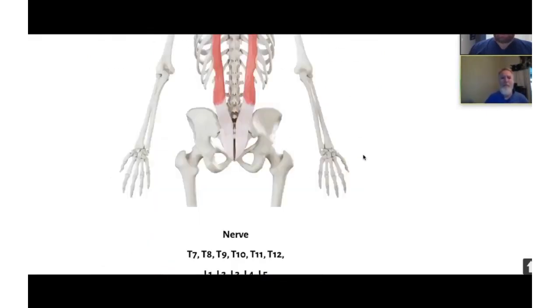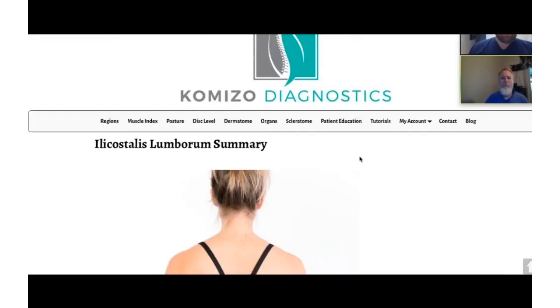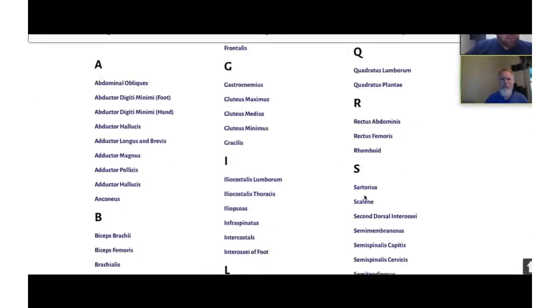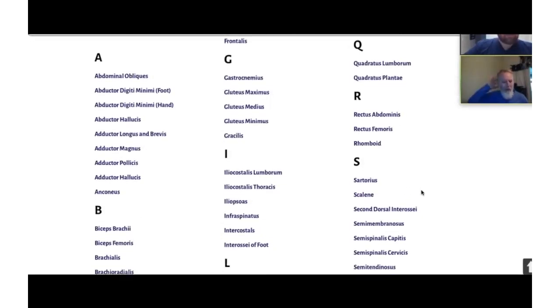So. Okay, no worries. So what we'll do is I'm going to show you another muscle that's pertinent to this one, and it could be... Are you getting headaches at all? Yeah, a little bit. Okay. Do you have any? Right at the base of my skull. Okay. Back of the skull. Do you ever get any temple headaches or anything like that? Rare. Okay. Usually it's more back of the head.